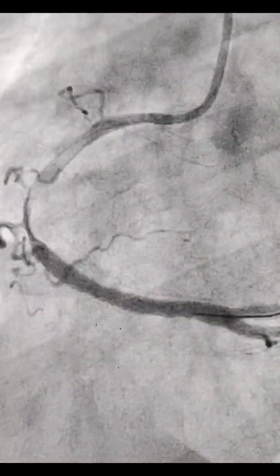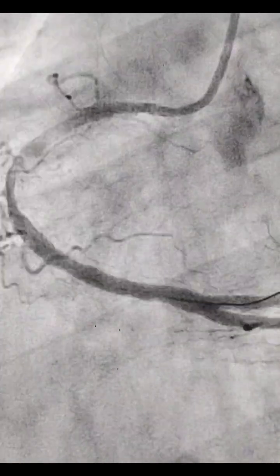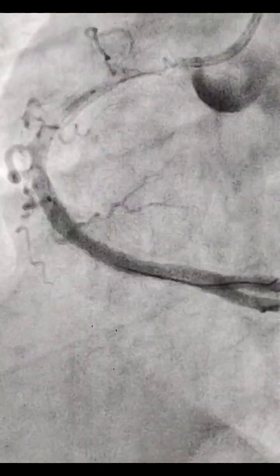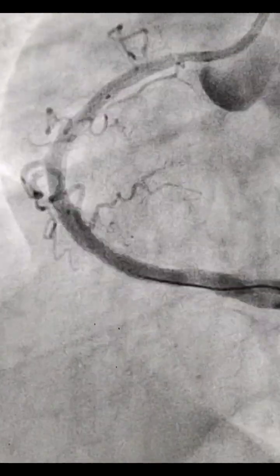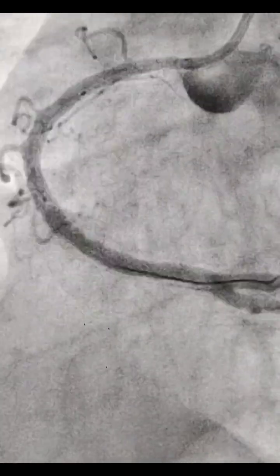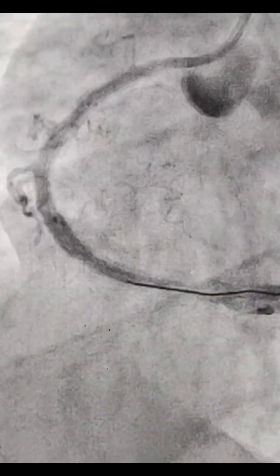So even after thrombosuction, after balloon dottering and all whatnot, after giving some tirofiban, nicorandil, NTG, this is the picture. So I decided to straight away put a second stent right from the ostium of the RCA to mid RCA. There's a cranial picture and you can have a clear-cut idea right from the ostium. I wanted to put a length 40 stent, but it was not possible to put such a long stent. It was not going. So I took a 28 stent so that I can cover that hazy part.